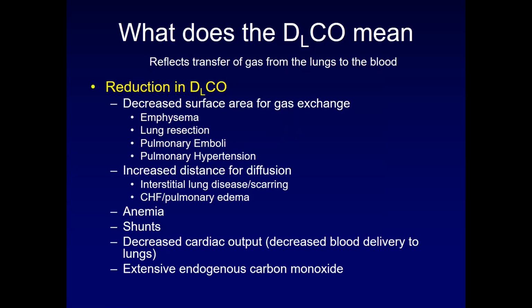So what does the DLCO mean? I just went through all this hullabaloo about how to collect it, what we're measuring. What does it mean when you're looking at a number on a piece of paper? Well, it reflects the transfer of gas from the lungs into the blood.